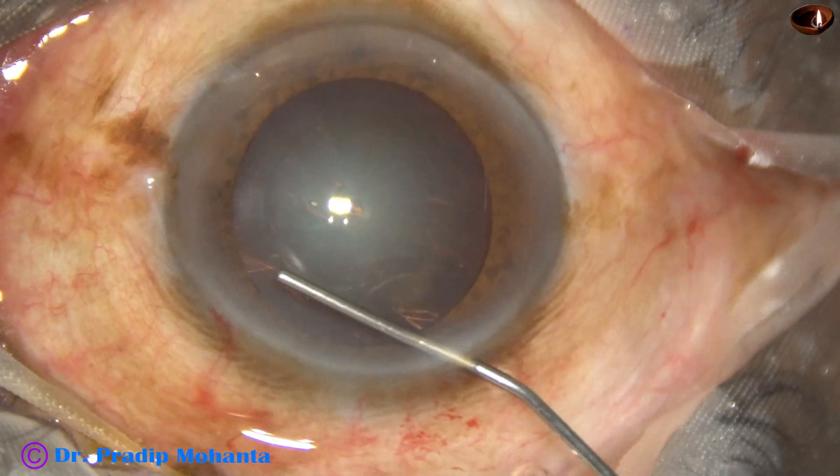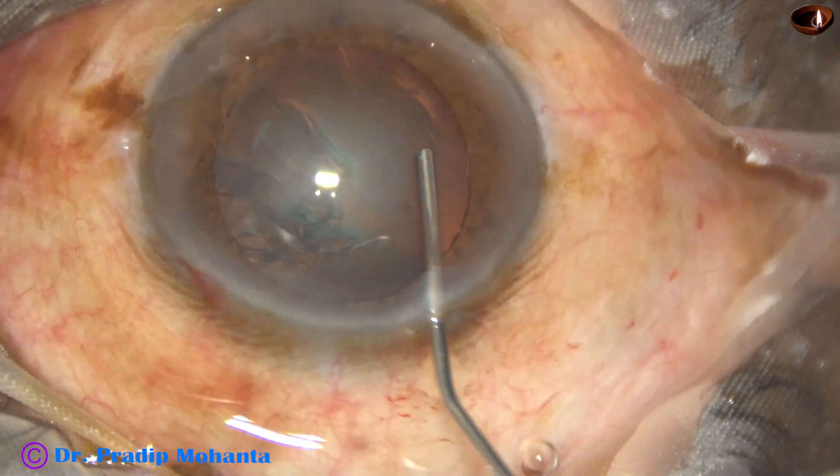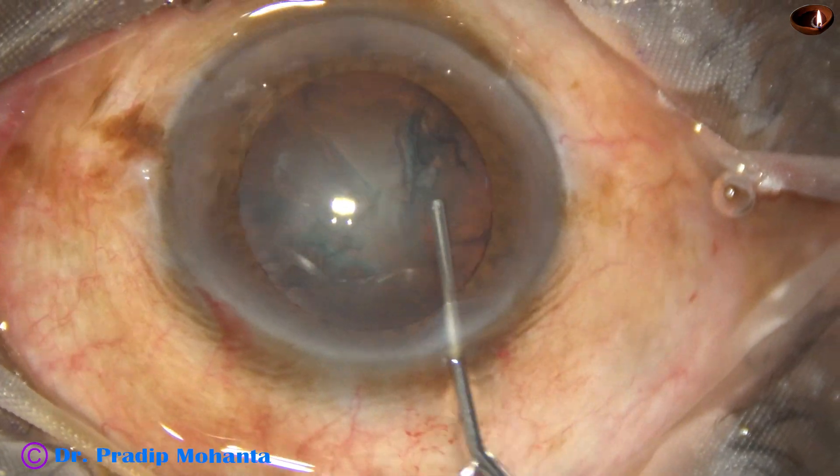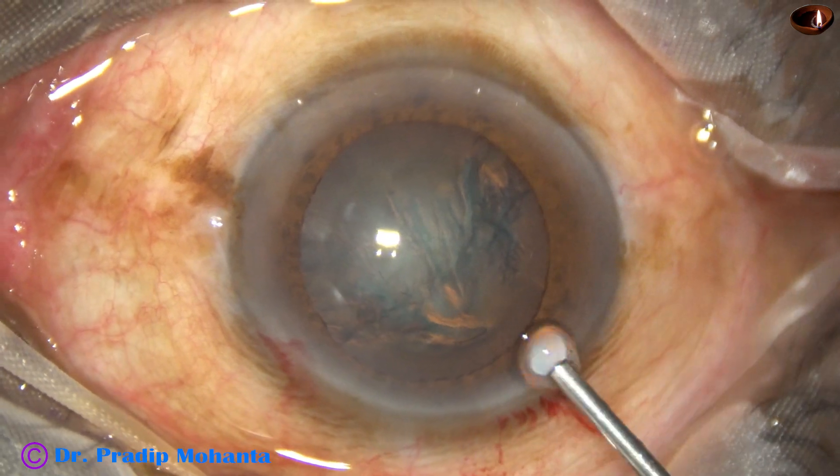Now hydrodissection is done with BSS. This is a 27 gauge cannula attached to a 2 cc syringe. The nucleus is mobilized.